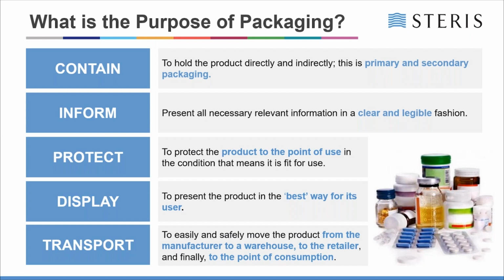To display the product in its best way for its user. So basically, if you're in a surgery or in an operating theatre, the nurse or the doctor must be able to look into the package to see what they're actually getting, or be able to distinguish what they're getting from the outside of the packaging, so they're not destroying sterile barriers before use.